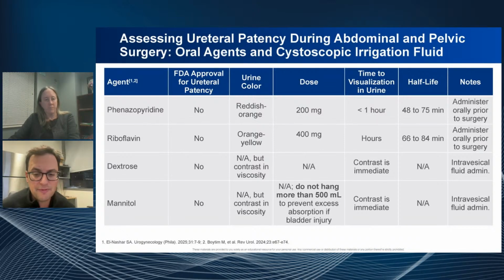And again, it's just a different density, like if you've ever been in a place where you have salt water and fresh water mixing. It sort of gives this cloudy appearance. That's from my scuba diving days, but you can see that with dextrose and mannitol. So those are the agents.